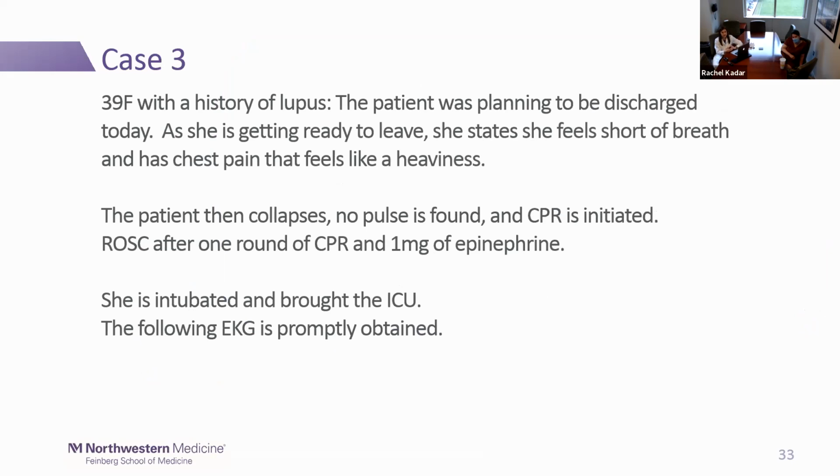The patient then collapses, no pulse is found, and CPR is initiated. There's return of spontaneous circulation after 1 round of CPR and 1 milligram of epinephrine. She's intubated and brought to the ICU. The following EKG is promptly obtained.